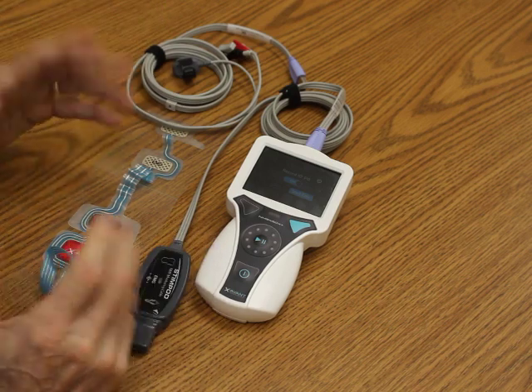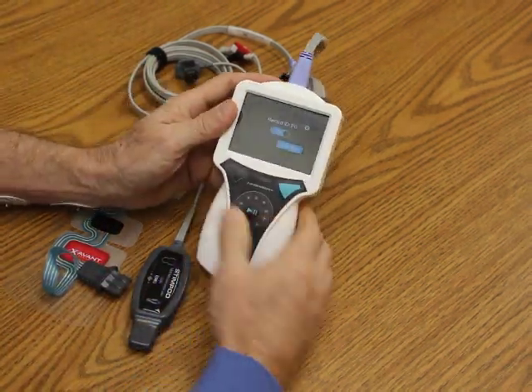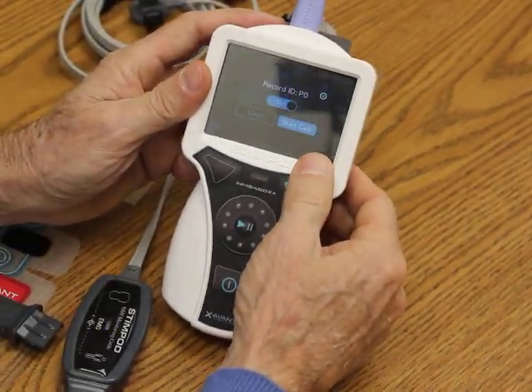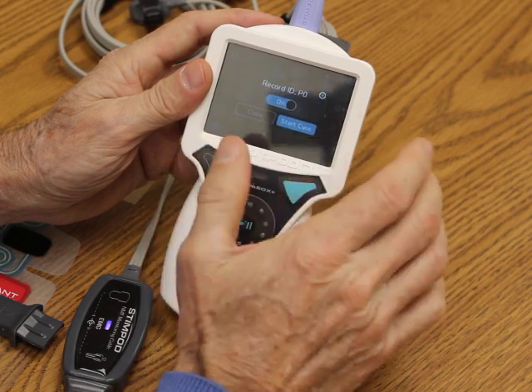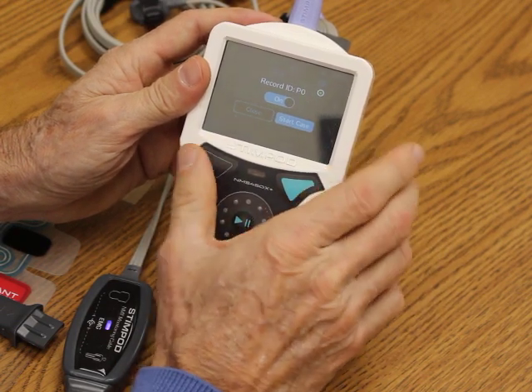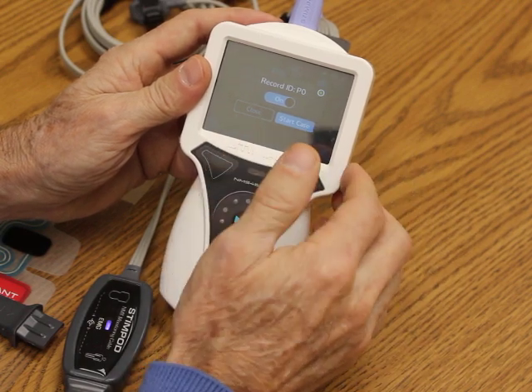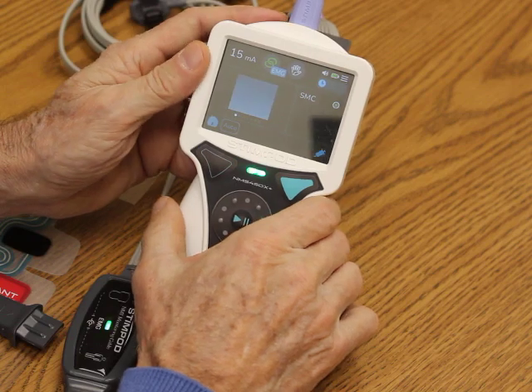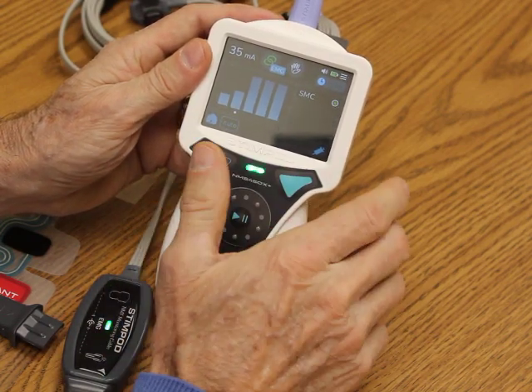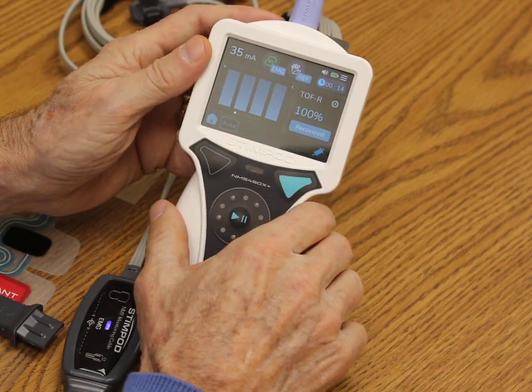The Stimpod when you power it up comes up with the message 'Start Case.' If I press Start Case, it's going to automatically identify if the patient has paralytic on board or not. If the patient has paralytic on board, it'll default to 60 milliamps and train of four. So we're going to start the simulation — it's looking for the supramaximal current, basically the ideal current to measure this patient at.